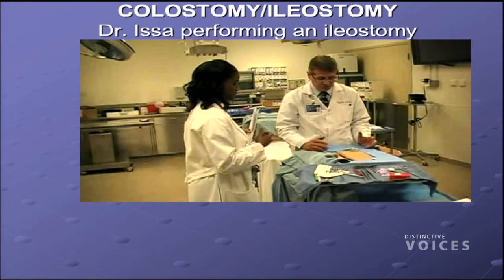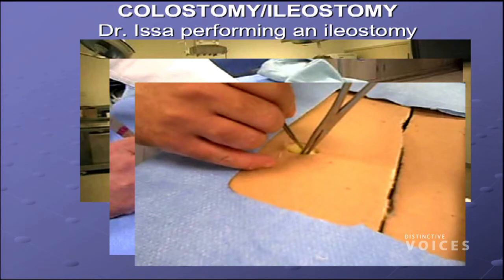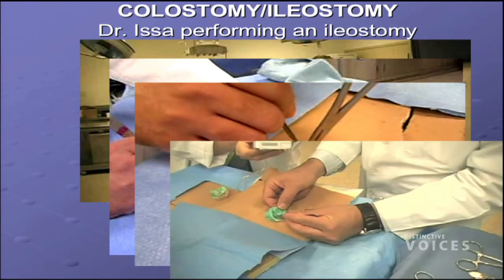These are pictures from a video. This is one of my colleagues at Northwestern, and I am interviewing him about his approach to doing an ostomy. These are fabric-based models that we've built and then farmed out to a company that now makes them. He goes through the process through the layers of the abdominal wall and then matures the ostomy. And that's where the layers are. There's a difference in terms of how you mature a colostomy versus an ileostomy in terms of the thickness of the bowel.